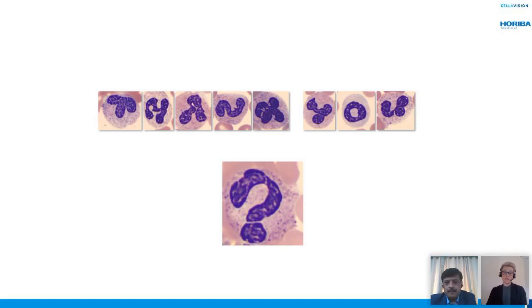Yeah, the risk is otherwise, as we have seen when we have run into troubles with the system, that the distribution of the white cells can be skewed if the smear is not properly made. And then, of course, the result that is reported will be wrong. So that's why it is of high importance. Okay. Yeah.